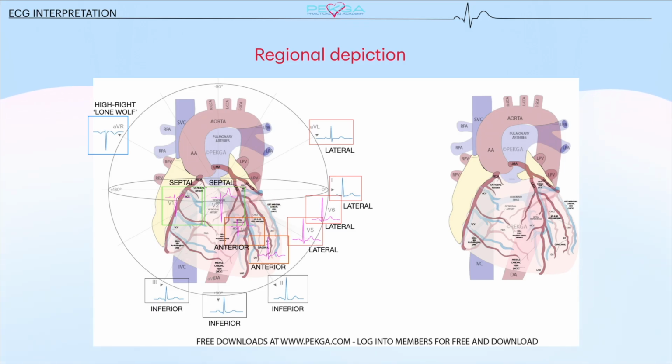Now, if you're looking at this and you're a complete newbie, you don't know anything about ECGs, or you just got into the ECG world, why did I do this when I was talking about lateral views? Because these leads are really looking at transition of the signal from left to right, and you can deduce on this side what's going on this side as well. So you can be inferring what's going on at the opposite end. The anterior leads here, and by the way, you can do that with all the leads. When you get into this game and you're talking about STEMIs, you're going to be talking a lot about reciprocal changes, right? The anterior leads are here.